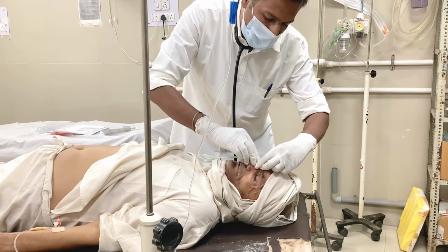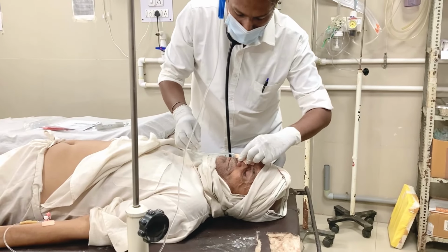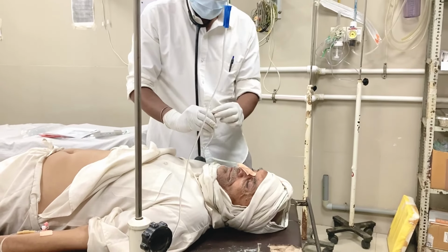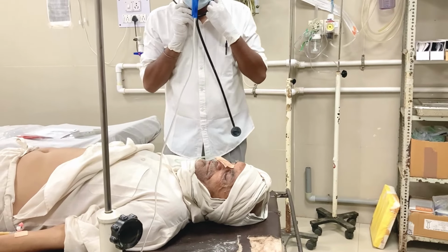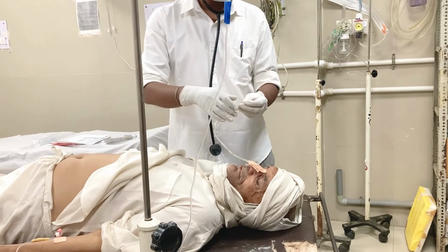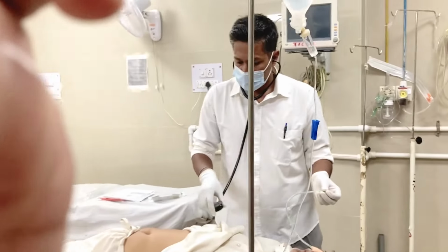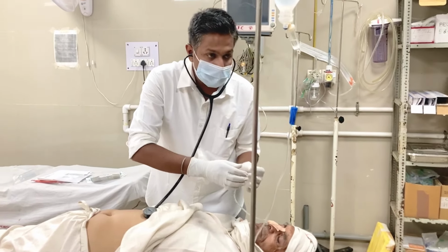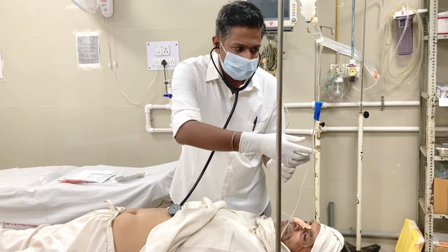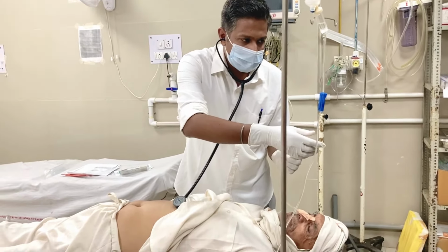The intragastric position of the tube must be confirmed after its initial insertion, and this must be documented in the patient's notes. There are various ways of confirming the tube's position. These are by the pH test of the contents of the Ryles tube, by X-ray, or by pushing air in with an empty syringe and auscultating the air puff inside.